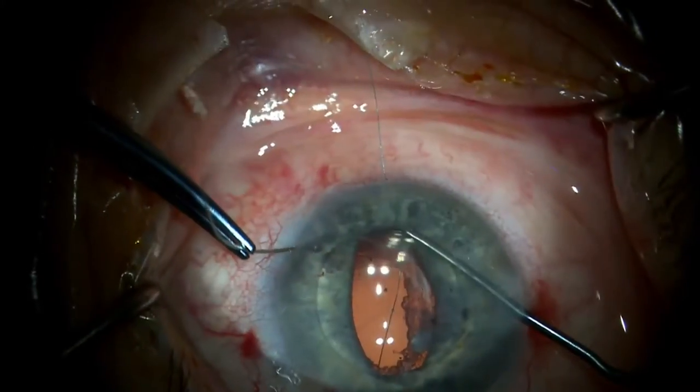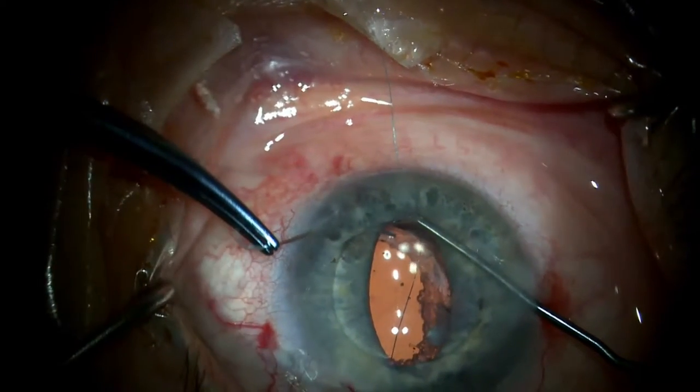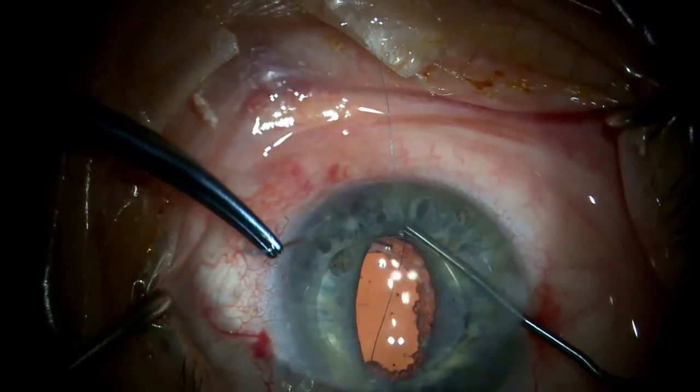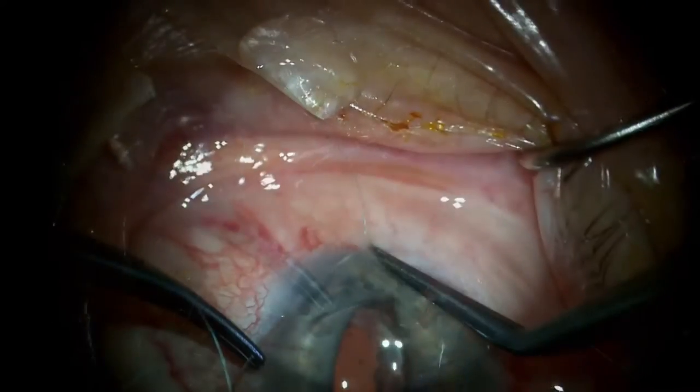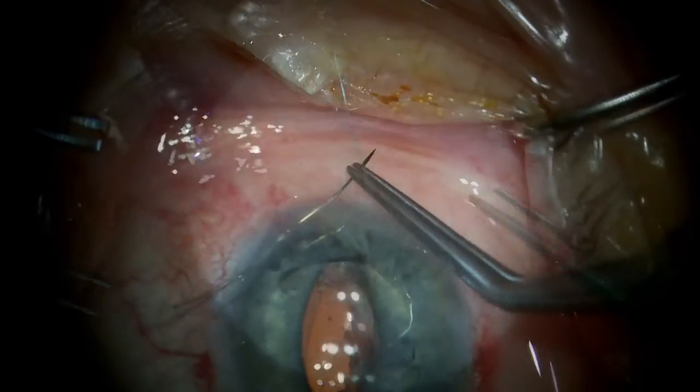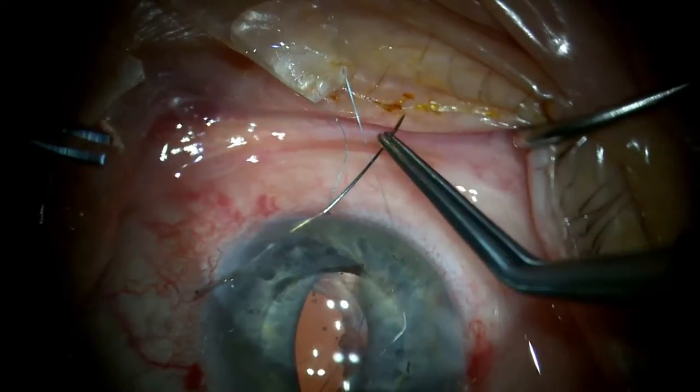The CTC-6L needle on 10-0 polypropylene passes down through the iris and under the haptic. The IOL manipulator pushes down on the iris while the needle tip comes up through the iris and then out through the adjacent limbus.